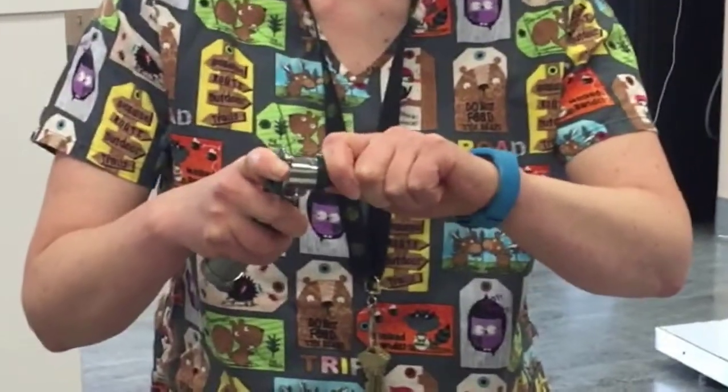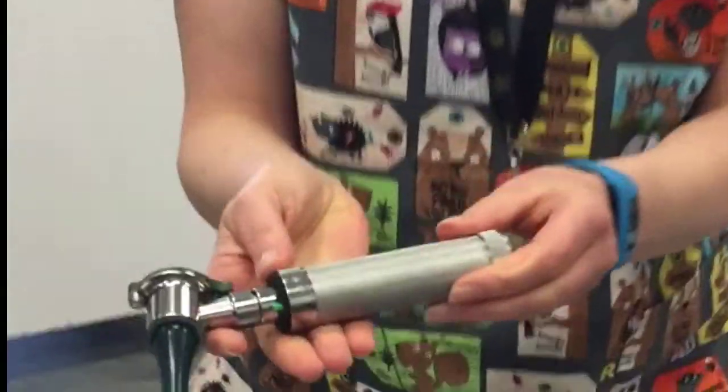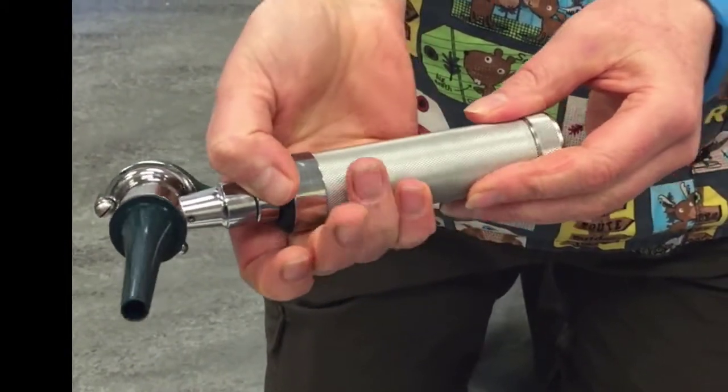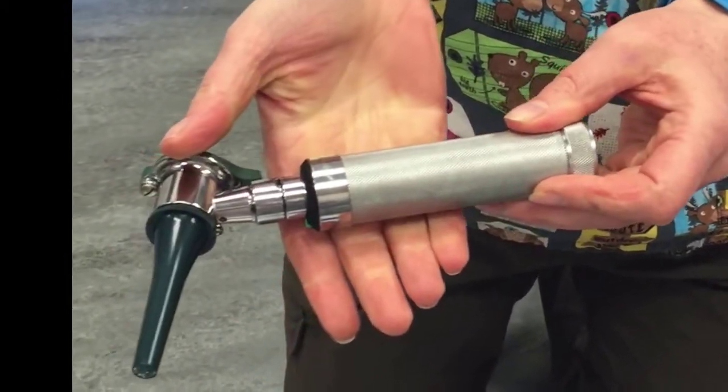First of all, you need to take your otoscope and a suitable sized ear tip. This is a pretty big dog, so we have a large otoscope tip. We're going to join them together, like so. And then you need to turn on the otoscope, which you do by pressing the green button here and then rotating. So now my otoscope is ready to use.